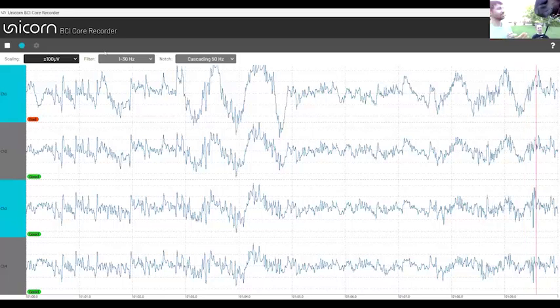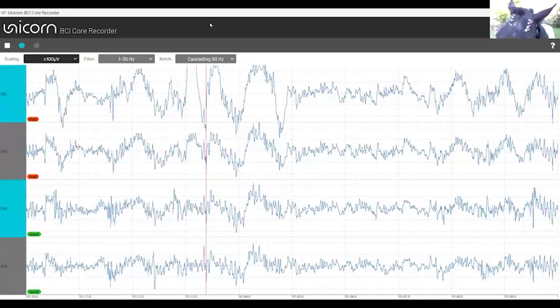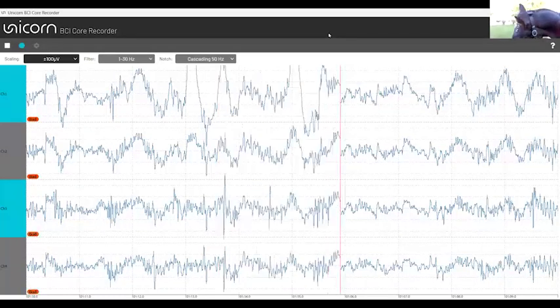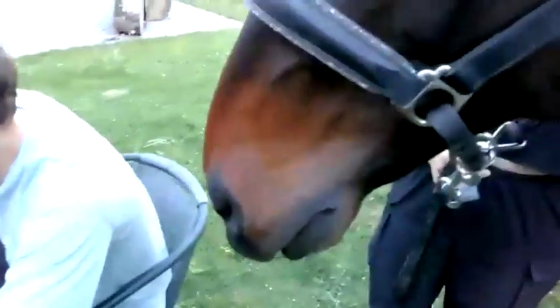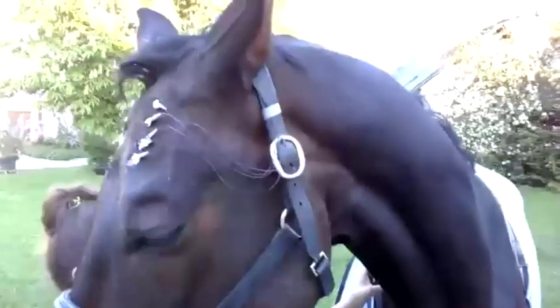Okay, so maybe Sarah can now film again a bit in detail how the setup looks, and I will stop sharing and connect the 8-channel BCI and share again. So let's go and take off the amplifier.